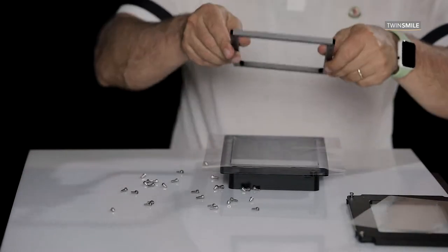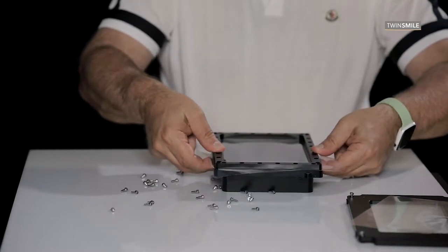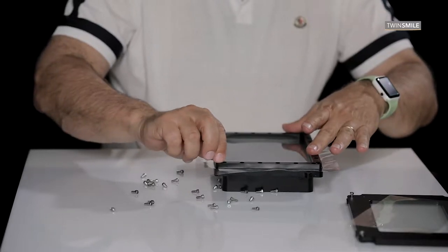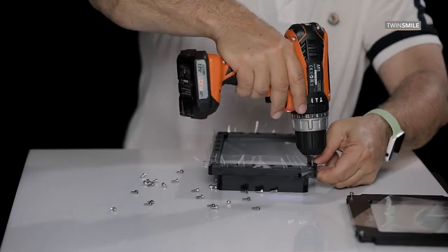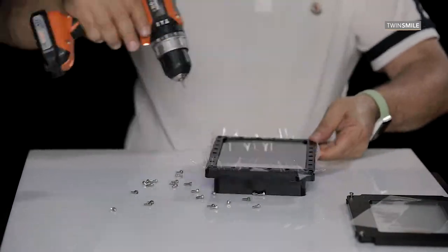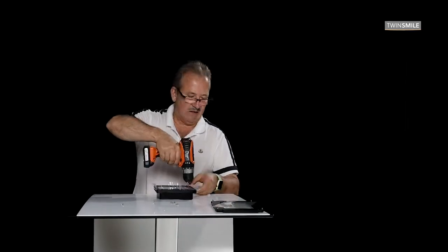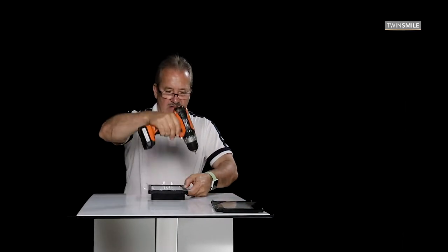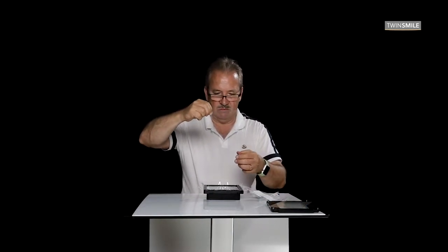Place the narrow frame carefully over the Teflon foil and start screwing it back in place. You will see how the tension builds up and the foil starts to stretch. After all the screws of the inner foil have been tightened, put the second etched foil in place.